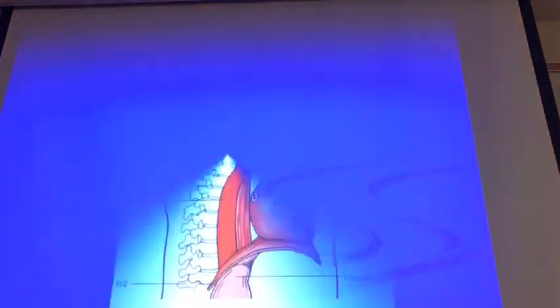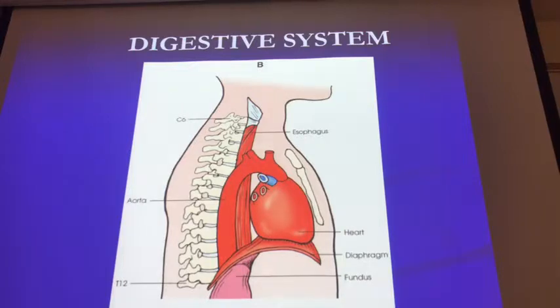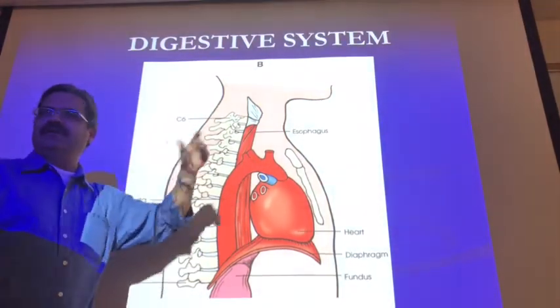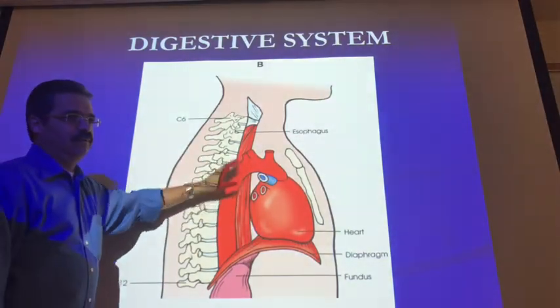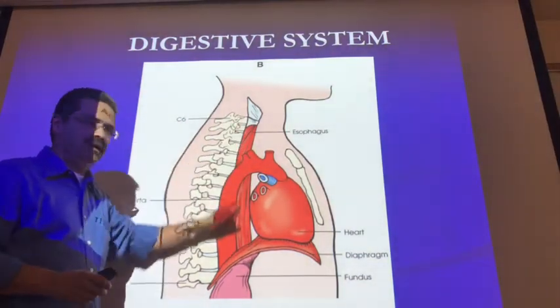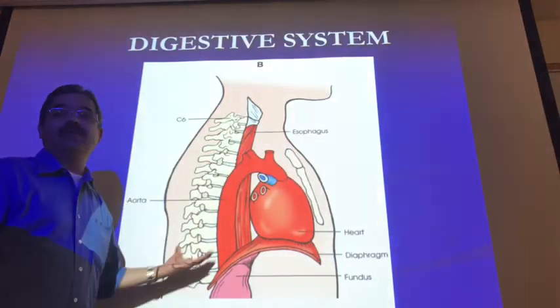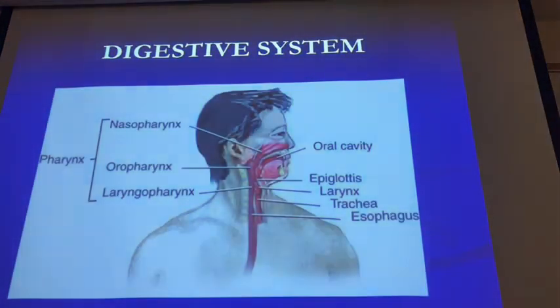And also remember that the esophagus, when you're not swallowing, will collapse. Sometimes, not often, you might have air trapped in the esophagus. That's common too, but sometimes you don't see anything. And so to be able to see the esophagus, you have to use contrast medium. Okay, a few more things.